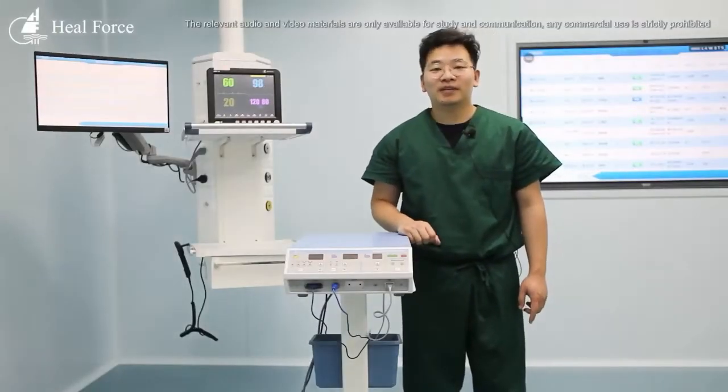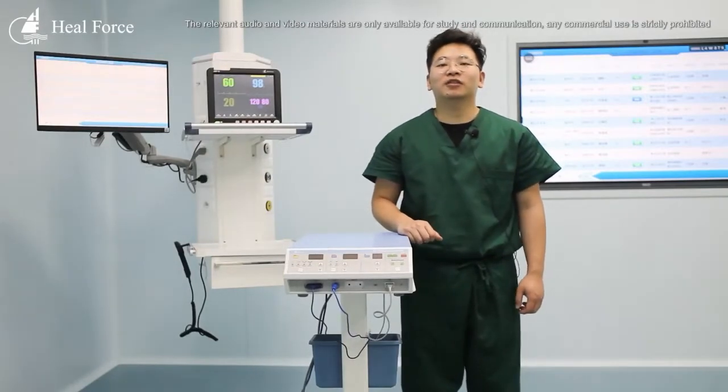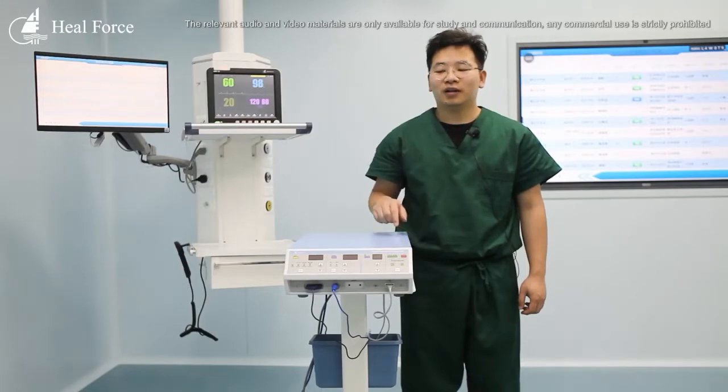Hello everyone, I'm Dean and I'm from Hillforce. Today I'm going to introduce you to two types of electrosurgical units.